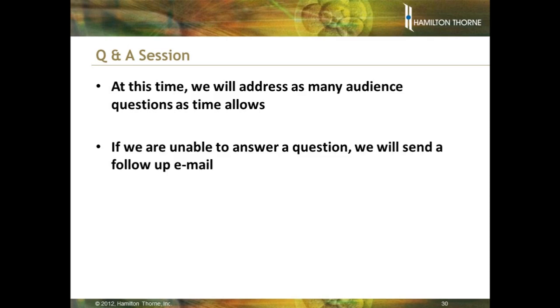Great. What portion of day 5 blastocysts do not herniate after day 3 breaching of zona, and what do you do in that circumstance? Again, this is very lab specific, and it really depends on how many blasts one's lab sees expanded on the morning of day 5.